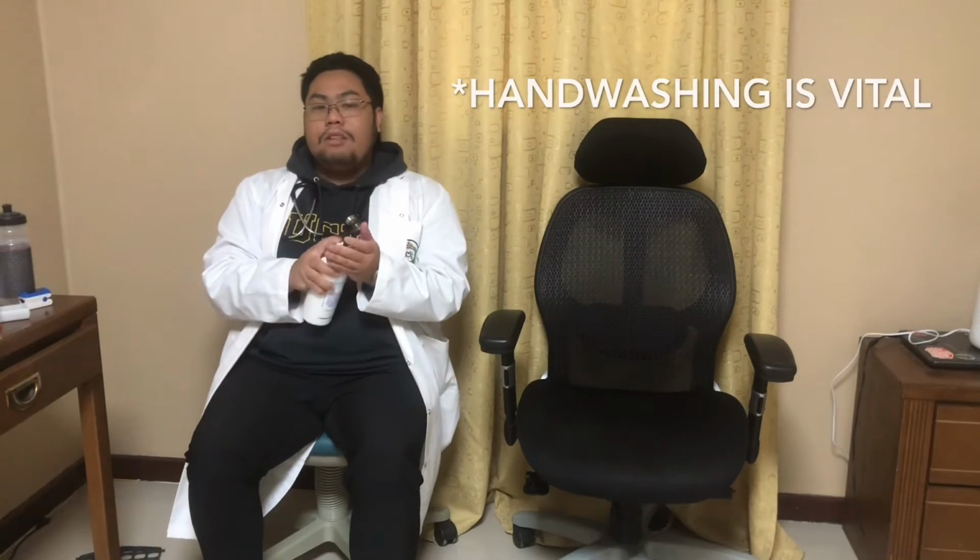Now after that, we're going to perform hand washing. Hand washing is the most vital part of the RD because it avoids any contamination and infection towards the patient and yourself.